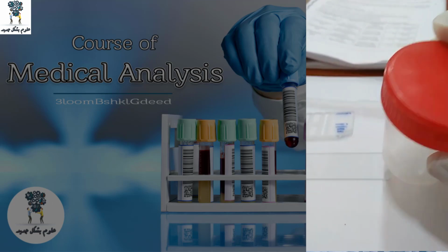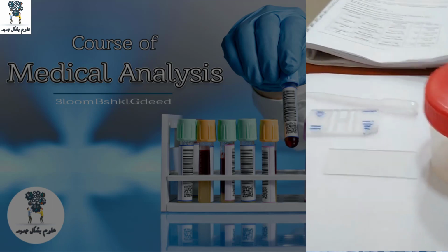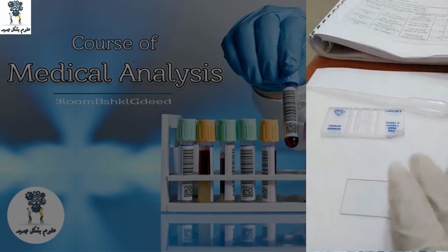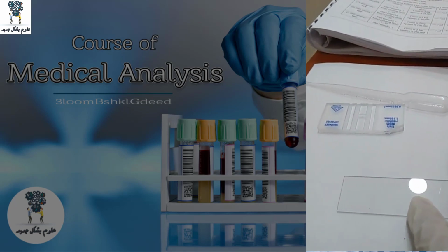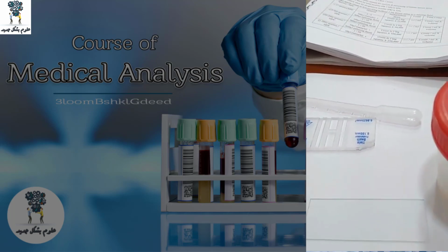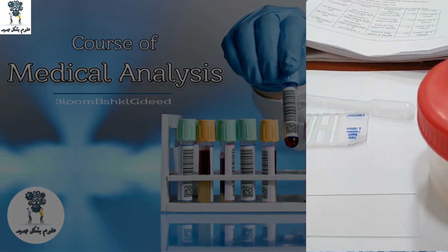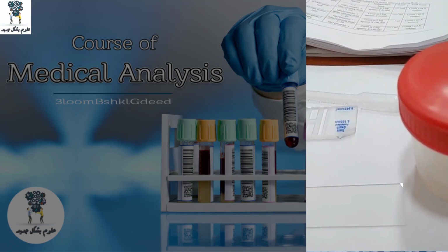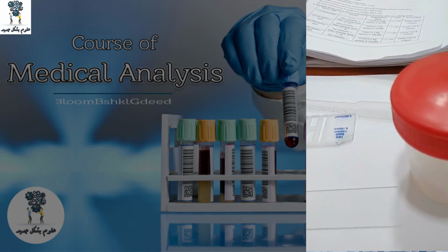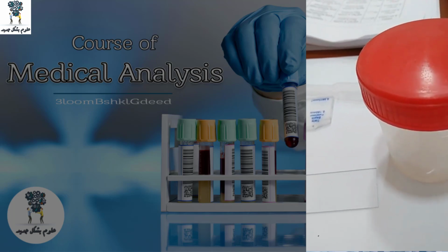After we do the physical examination, we will transfer to the sample itself. We'll check it. We have two slides: a normal slide and a slide for the count. So what will we see in the normal slide? In the normal slide, we will check the shape of the sperm and the movement of the sperm. So there are different cases. Not all cases are normal.